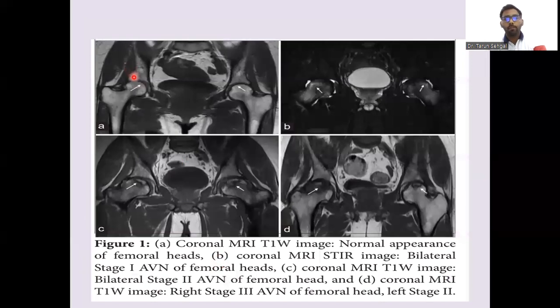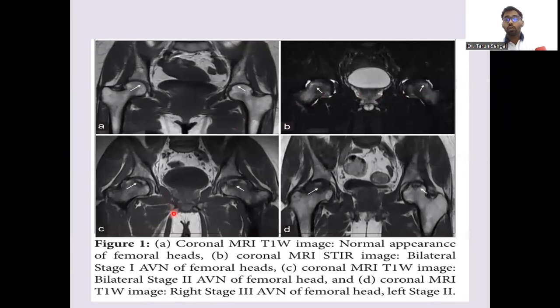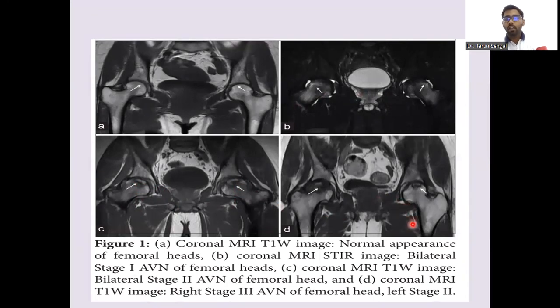In coronal MRI: image A shows normal appearance of the femoral head. Image B is a coronal MRI STIR image showing hyperintensities suggestive of bilateral Stage 1 AVN. The third image shows coronal MRI T1-weighted images with bilateral Stage 2 AVN of the femoral head with visible osteonecrosis. The fourth image shows coronal MRI T1-weighted images with right Stage 3 AVN and left Stage 2 AVN of the femoral head.